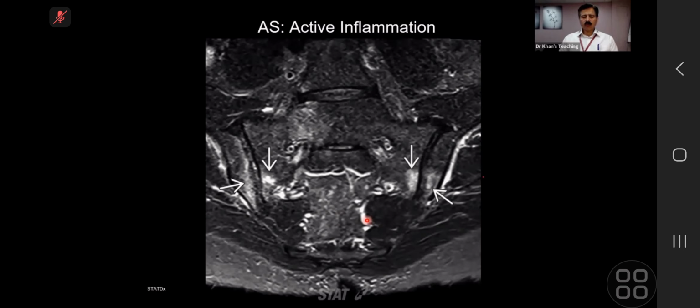Now, for seronegative arthropathy, the rheumatologists advise a lot of MRs. We call it spondyloarthropathy protocol, or whatever your department wants to call it. Basically, all of these are 2A as well as 2B questions. For 2A people, these are usually asked. Basically, we do T1 and stir sequence through the SI joints: coronal and axial T1 and stir sequence. Similarly, we do the whole spine, and in the whole spine, we do T1 and stir sequence.